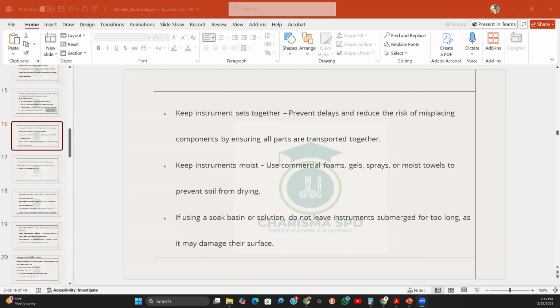And given that we need to, in central sterile processing terminology, turn over set A, meaning we need to prioritize set A and process it quickly to be used on another patient for another case. If set A instruments were packed in set C, what do you think this action will result in? That's my question.